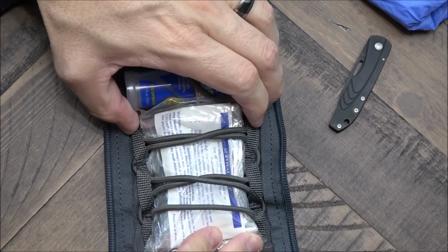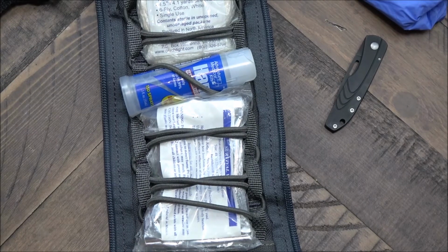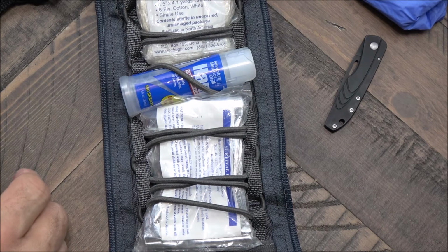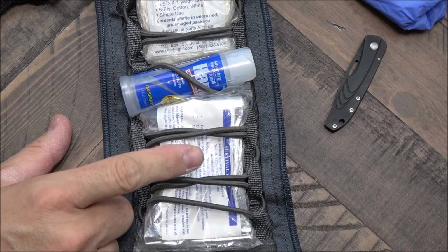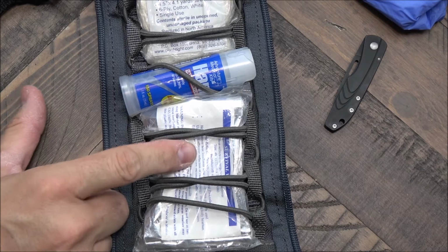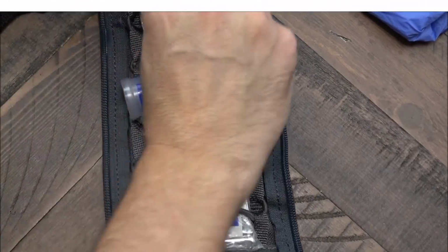This thing's a bear to get in here, so I'm going to actually leave it. This is basically just a survival blanket. Patients can go into shock whether it's wintertime, summertime, whether they've seen a traumatic incident or they've experienced some kind of traumatic injury to themselves. Patients can go into shock for a multitude of different reasons. So this is completely critical for you to keep, in my opinion, in your medical kit. You can save somebody's life with this.